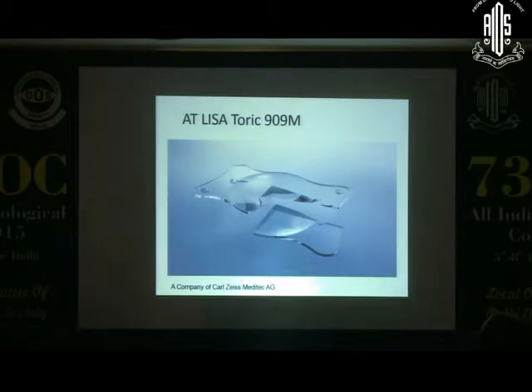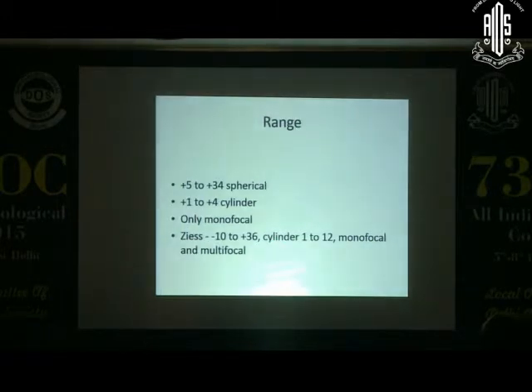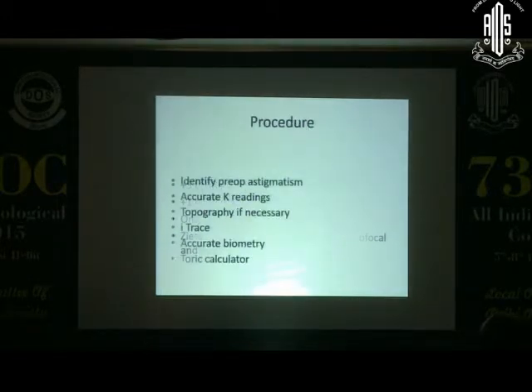This is the design of the plate haptic, where it is the long axis, the line can be seen there. That's used for placing the lens in place. I'll skip this because this has been covered already by Dr. Teague.